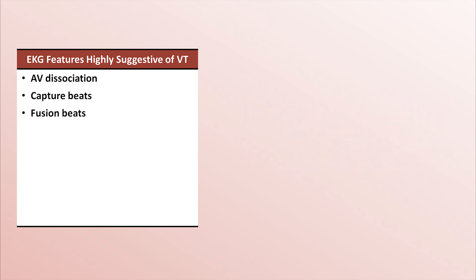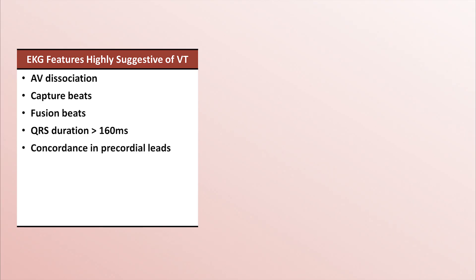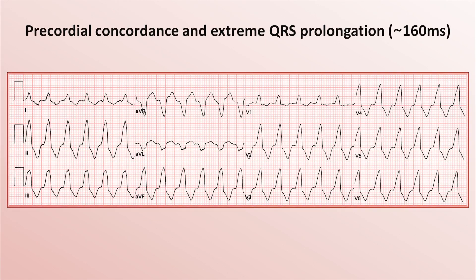Another feature is a particularly long QRS duration, above 160 milliseconds as a rough cutoff. There's also something called concordance in the precordial leads. Concordance means that among leads V1 through V6, all of them are either fully upright or fully down-going. Here's an example of both concordance in V1 through V6 and extreme QRS prolongation.